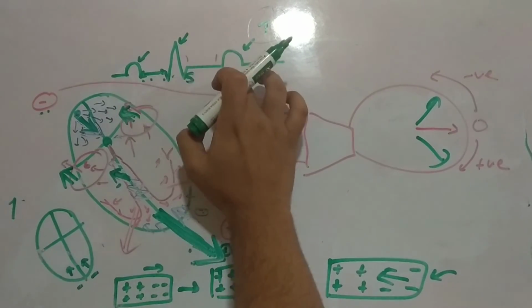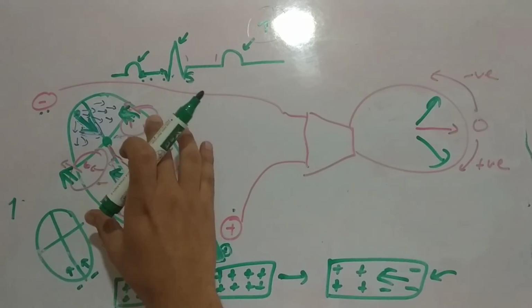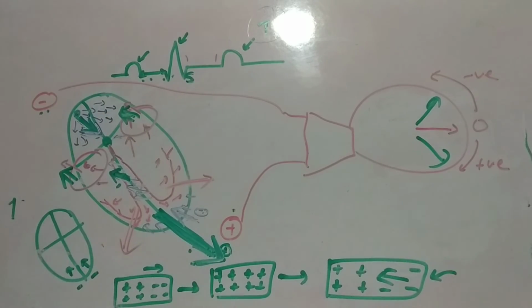The ST segment is nothing but the representation of complete ventricular depolarization. So in this phase everything is depolarized, so there will be no electrical changes. The galvanometer or the ECG does not pick up anything, so there will be no deflection. The ST segment will also be an isoelectric line.